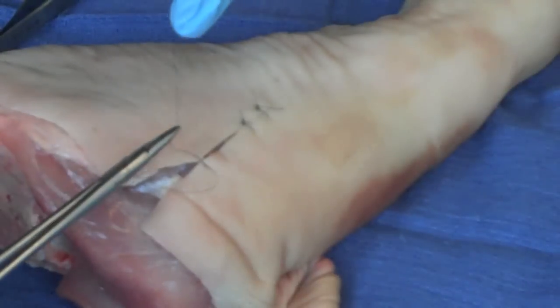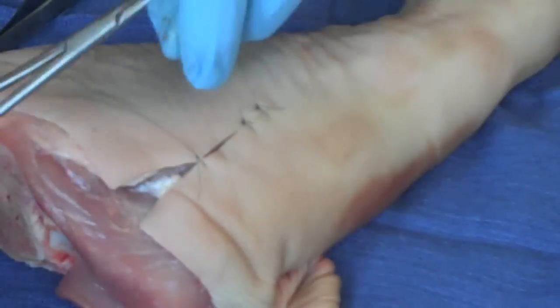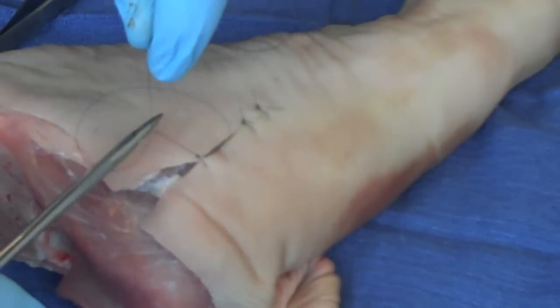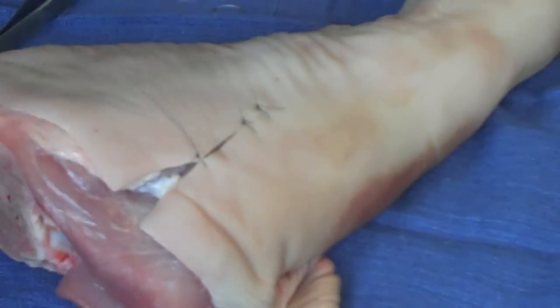I don't pull it too tightly because the wound edges will buckle on themselves. They join just adequately — not too tightly, not too loosely. That takes a little practice and you always want to err on the side of safety and not pull too tightly. If you do, you may break a nylon suture and have to do this suture over again.